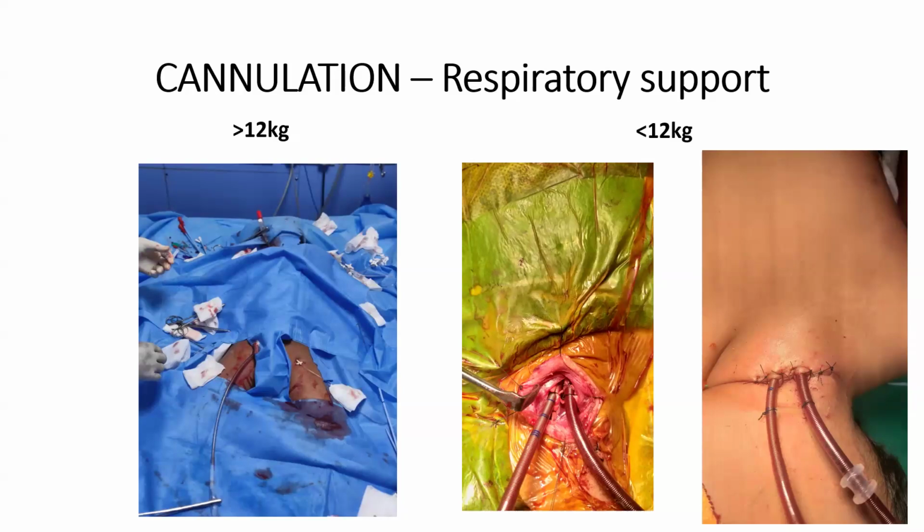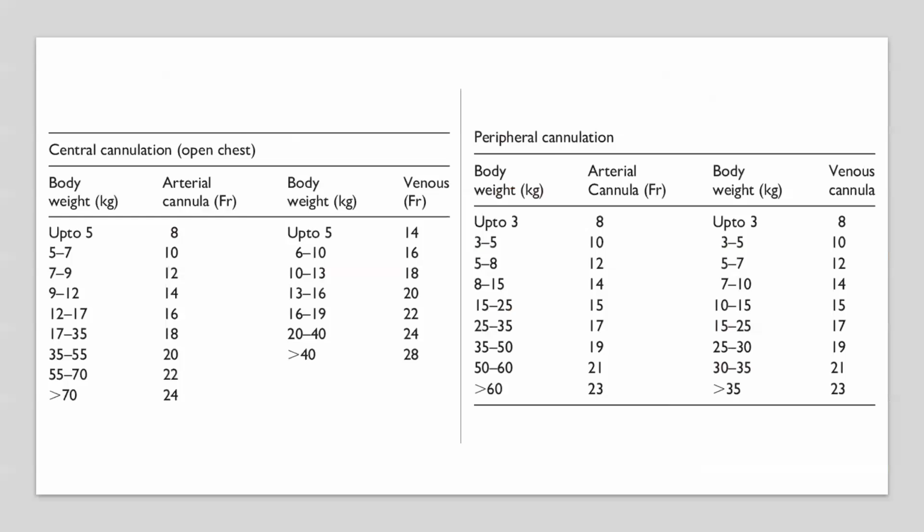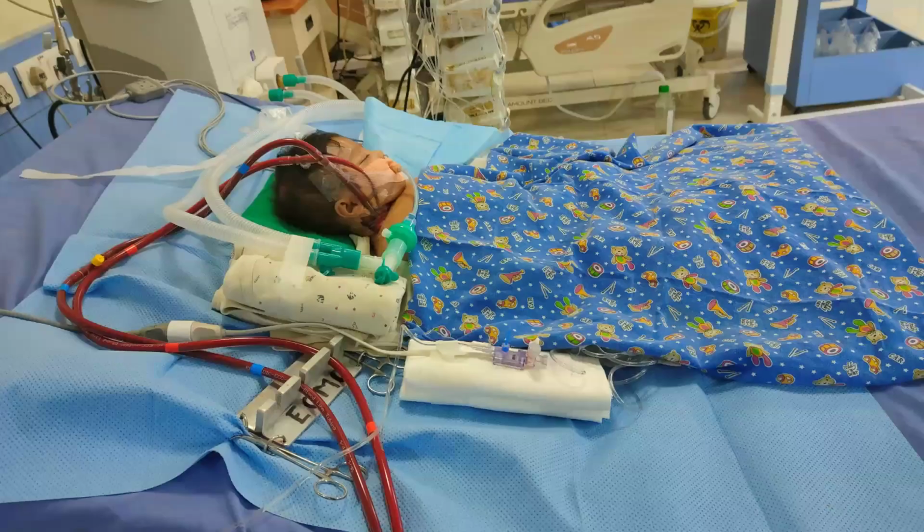And you can choose the largest size cannulas that can go in, because the largest size cannula will give the best flow in this population. Unless you have an adequate flow, you will have all the complications of ECMO going in the next few days. Before concluding, I'll give a couple of examples where cannulation strategies were important and what mistakes we made and how we corrected those mistakes.